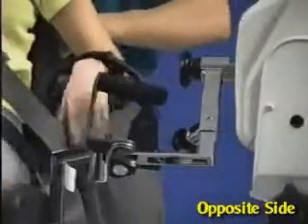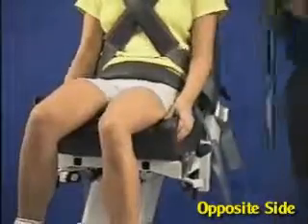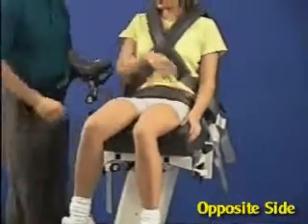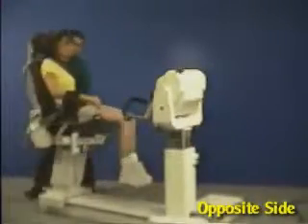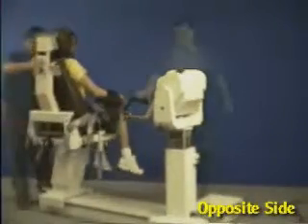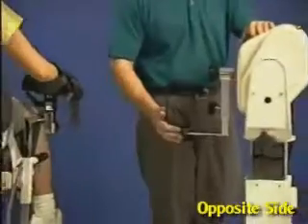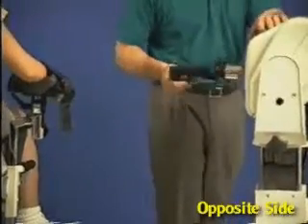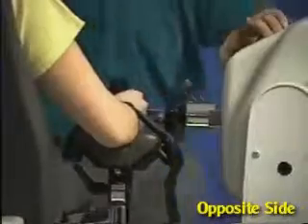Move patient back and unstrap arm. Move limb support to opposite side of chair. Secure arm, rotate chair to opposite zero degree mark, slide dynamometer into position, and rotate wrist attachment 180 degrees. Move patient into position and set range of motion stops.